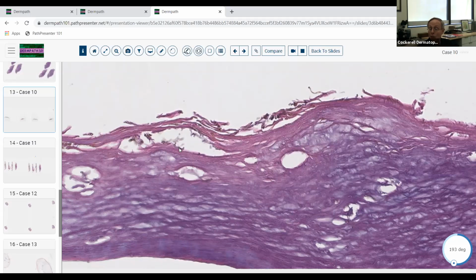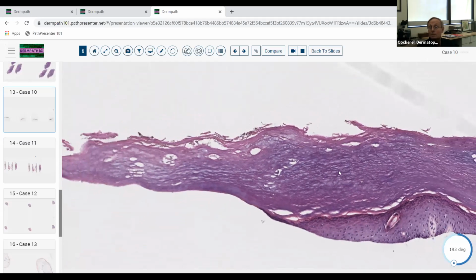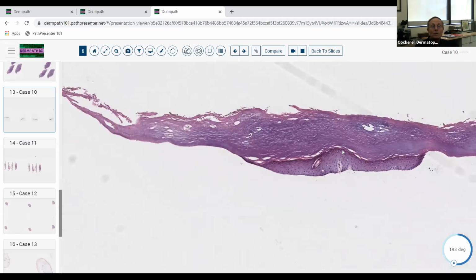And we can make the diagnosis if we get the cornified layer, but often it doesn't even get down into the epithelium. And theoretically, you can get Tinea nigra and a melanoma. So just because we can diagnose something as Tinea nigra, make sure that you haven't missed an acral melanoma. You really need to take a good deep sample that samples a representative area so we can see if melanocytes are present, and if they're dendritic going throughout the entire thickness of the epidermis, or if they're individual melanocytes that are pagetoid, which often aren't present on acral skin. You just want to make sure you get a representative sample. So beware of shave biopsies on volar skin.